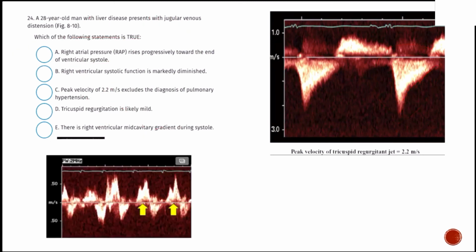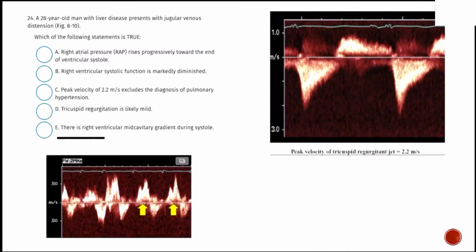All right, that's it. This is hard. Just a simple question on that. So the bottom, it was like the negative flow, is that just because of TR jets? This thing right here? Yeah. This thing? No, the other side. Yeah, the last one. What do you mean, the bottom? Is that the systolic? So if you look here, during systole, your RV is contracting, and you have your jet looking right over the tricuspid valve, so you're not going to see forward flow, right? Because it's a chamber. Oh, so that's the regurg. Right. So you're looking at the regurgitant jet through your tricuspid valve.